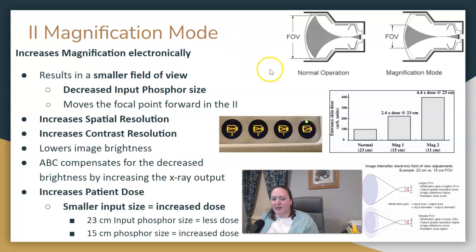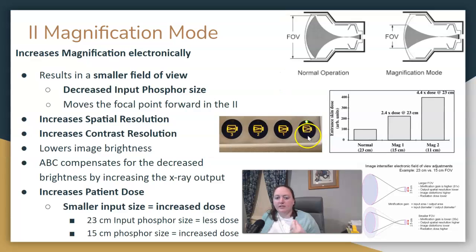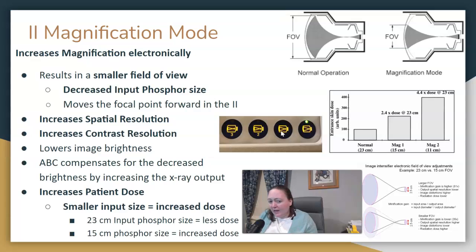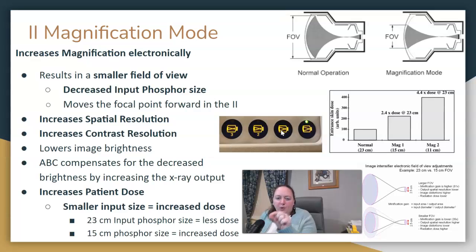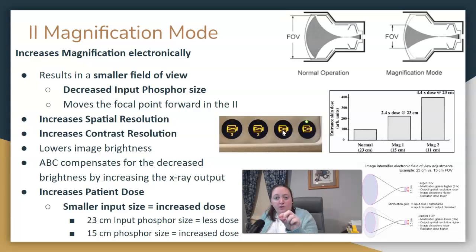Obviously, we're able to see a larger image, but what's going on in the background? When a radiologist wants to mag up and magnify the anatomy to look closer and get better detail, remember those electrostatic lenses that came together at a point before the anode or output phosphor? That point is called a focal point. When you magnify up, that focal point moves forward, closer to the input phosphor.